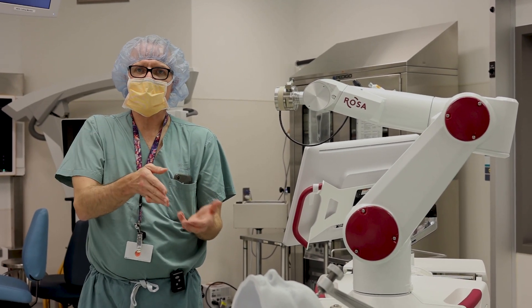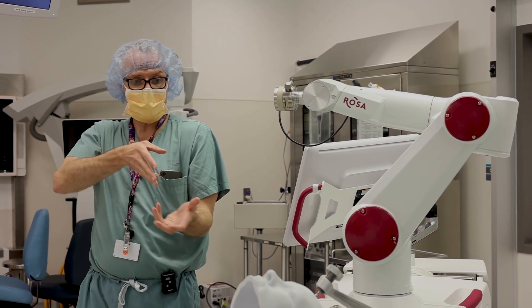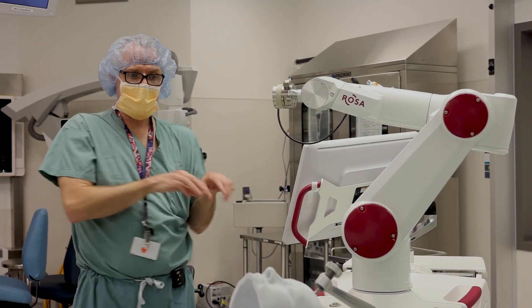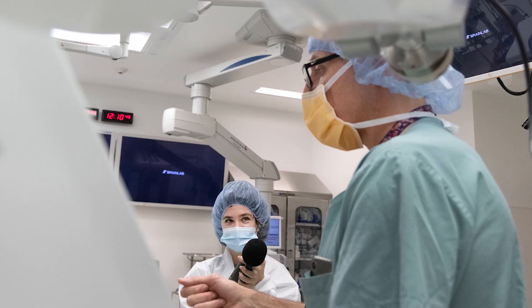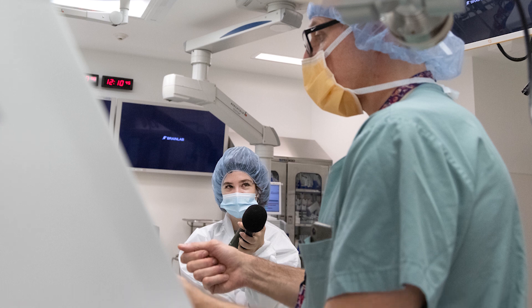Because we're doing everything through this rigid arm, this arm is now acting as what we call stereotaxy. Stereotaxy is a way of doing things in three dimensions and getting to a specific point in three dimensions. Rosa's arm is going to keep that trajectory for us — that trajectory was something I made in the computer before the surgery to get to the target I wanted and avoid any blood vessels.